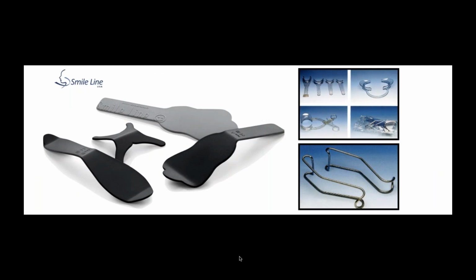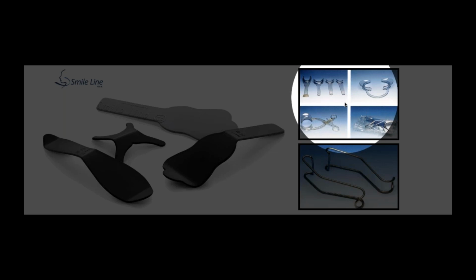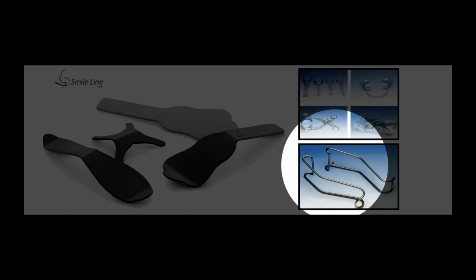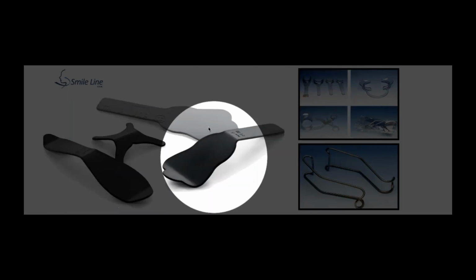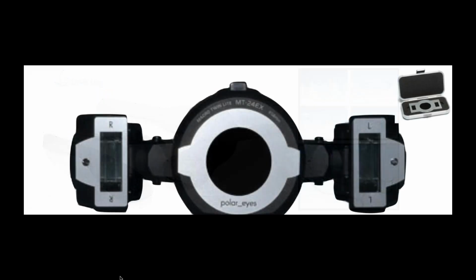Also, if you're in a laboratory or a clinical environment, the right tools are important. I tell you to stay away from these plastic lip retractors. They look terrible in this hygienic world today, especially after what we've all been through. They don't seem like the most sterile instruments that we could have, so I avoid them. I'd rather you shoot with metal retractors. The beauty of the metal is they stay cleaner, they're easy to clean, they're easy to maintain, and they don't discolor and change the coloration of the photography as you're working your way through. And also owning a black background is important for you, or a gray background if you want, to black out or mask some of the things behind it so you can get some better shots.